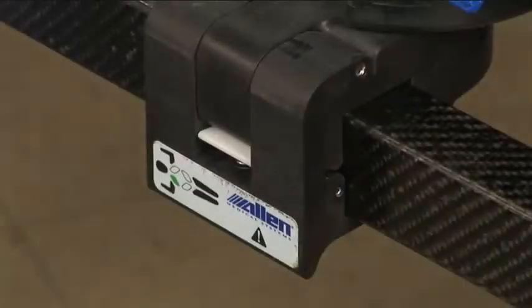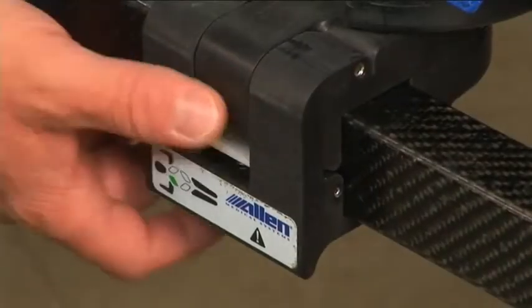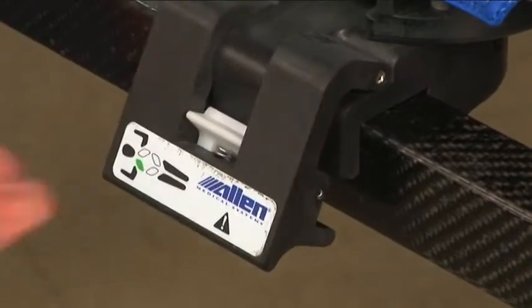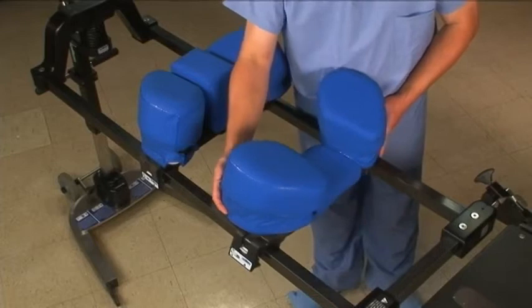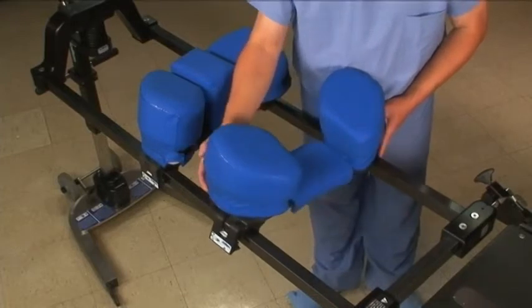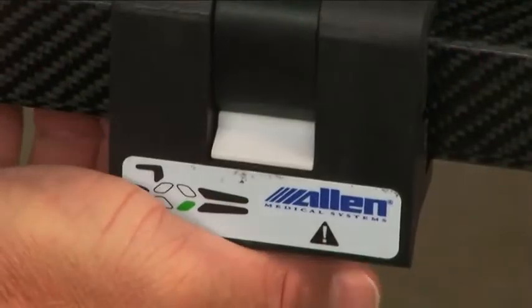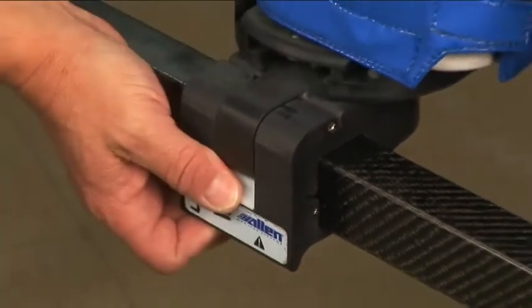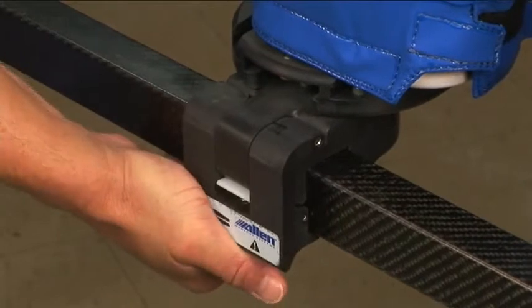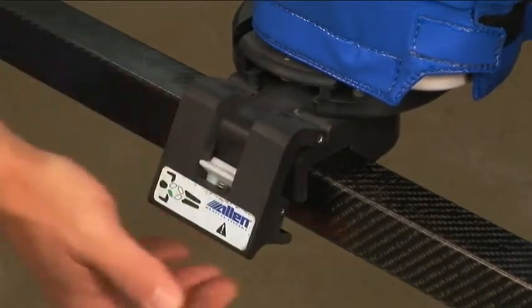To release the Wingset latches, press down on the white button with your thumb and pull back with your fingers. The angle of the Wingsets is adjustable. With one side latched, slide the other side along the frame. Close the latch using the heel of your hand. The latches might be a little stiff at first — open and close each latch several times to help break them in.